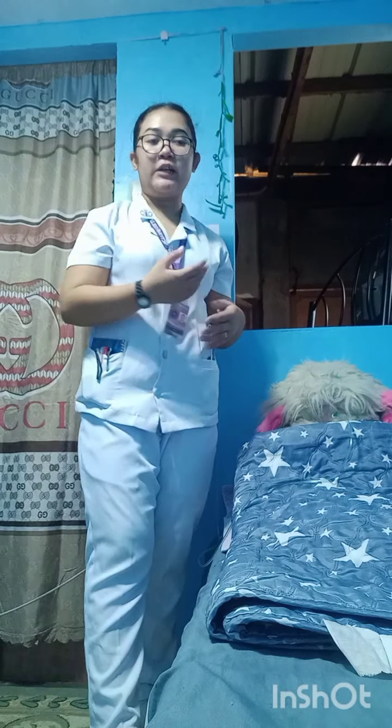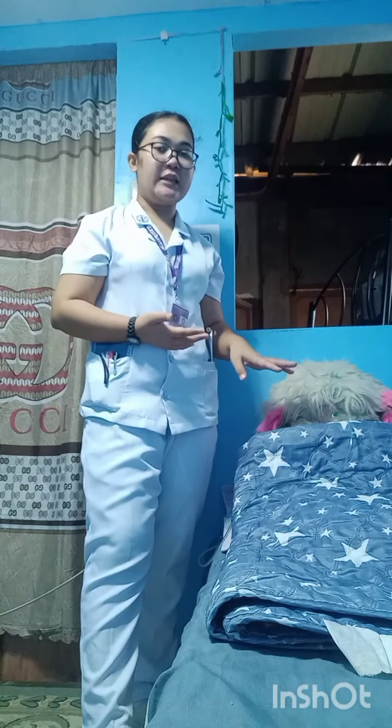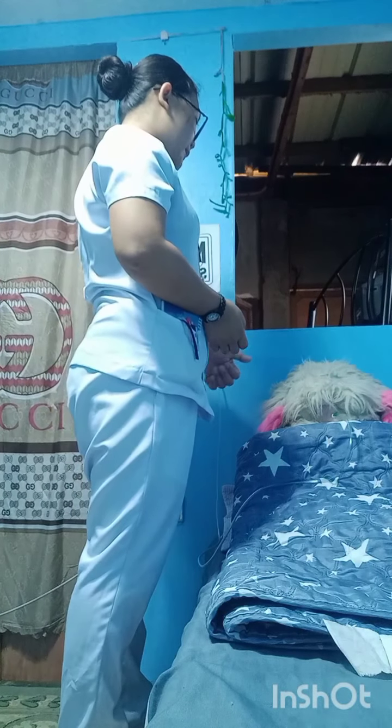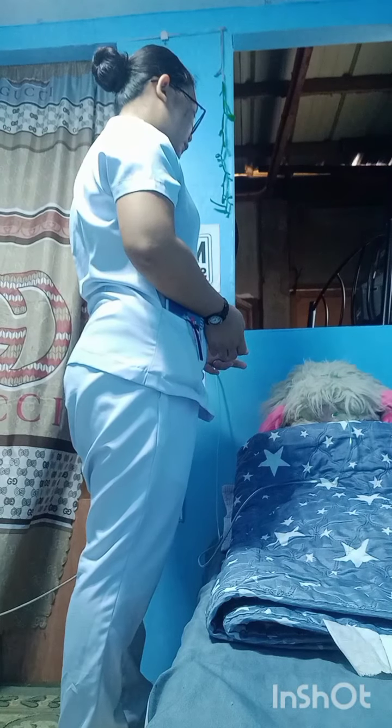Kailangan natin sila i-approach. Kailangan natin sila i-question, tanungin kung okay lang ba, ano bang nafe-feel nila, mga ganon. Tsaka, kailangan natin din kunin yung vital signs para ma-base data tayo sa paglagay natin ng cannula ng oxygen sa ating patient. So, ma'am, okay lang ba ang atong paghinga, pagbutang na ako? Walay lain.